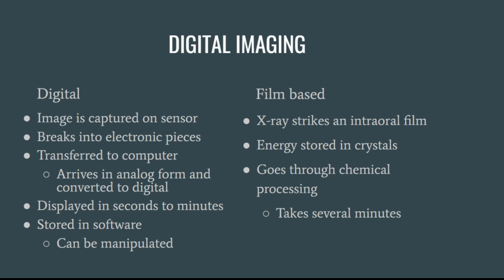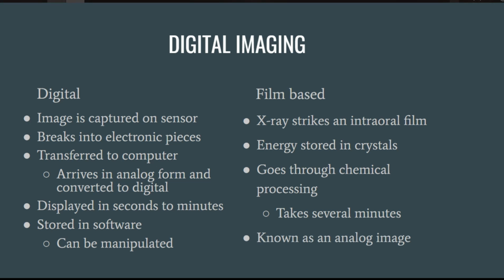It can be quite lengthy, and sometimes you don't have the time to wait, or you would like to not have the time to wait, but given the situation, you have to wait for those films. And this is known as an analog image when it comes out.